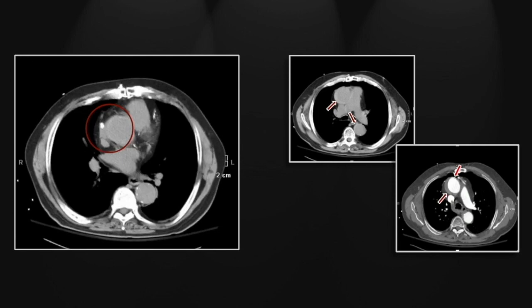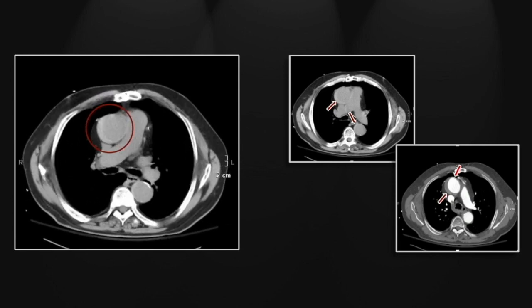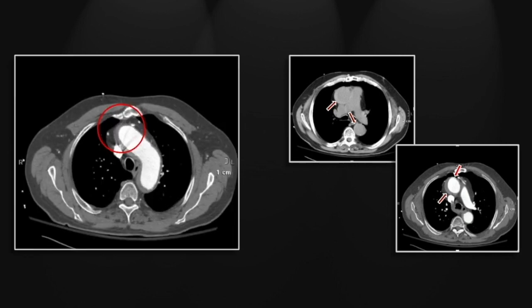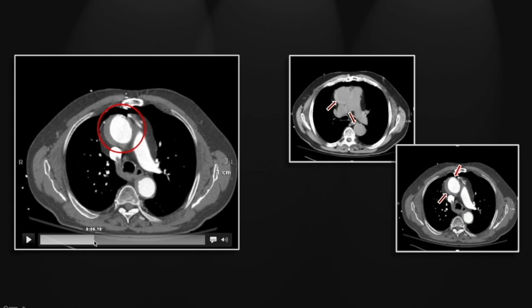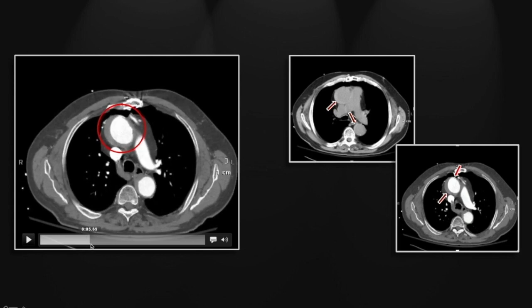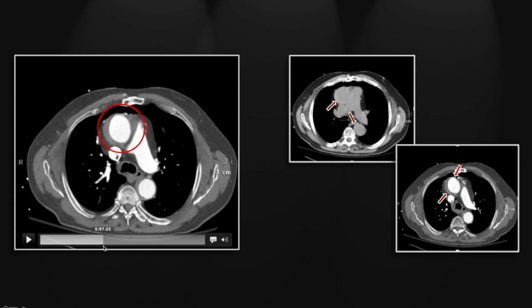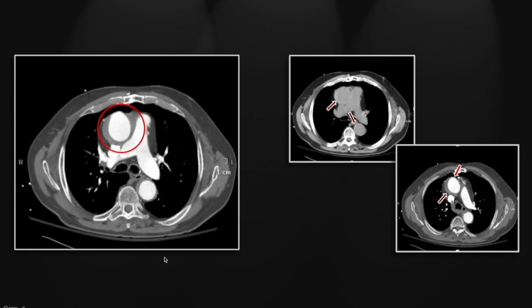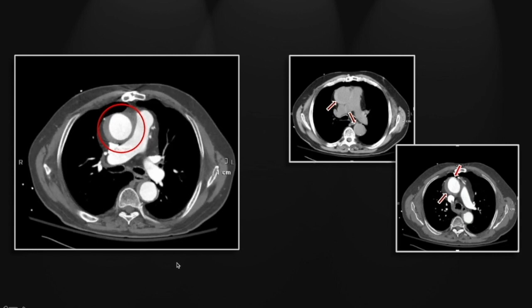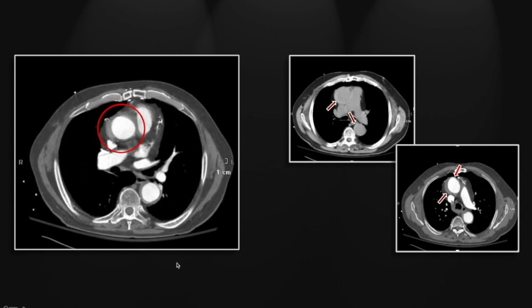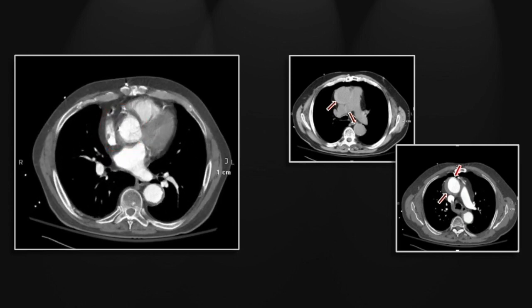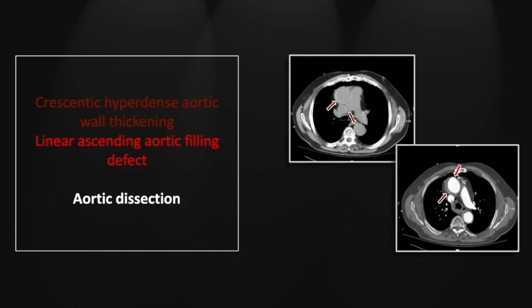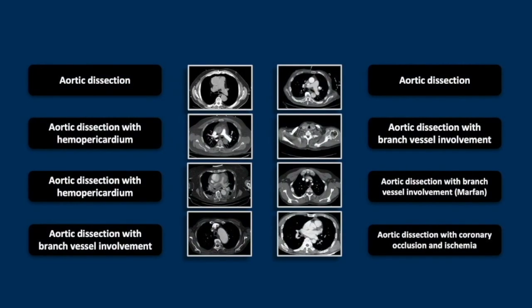There is that hyperdense crescent on non-contrast imaging, and on the contrasted study you can see the distortion of the ascending aorta. Note the small dissection flap and contrast material within the aortic media. You can follow that hypodense crescent all the way to the undersurface of the aortic root. So that is a classic aortic dissection on contrast and non-contrast imaging.